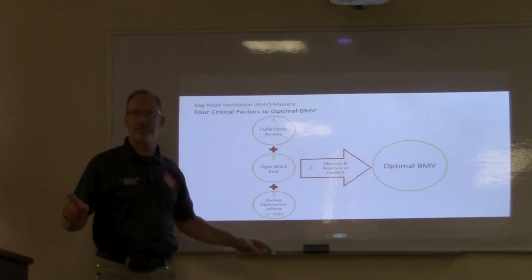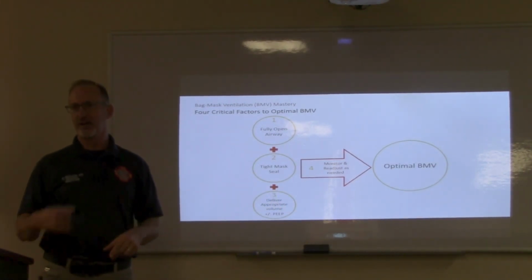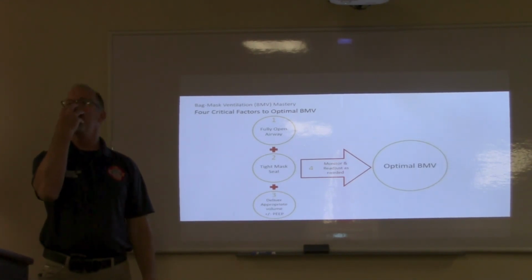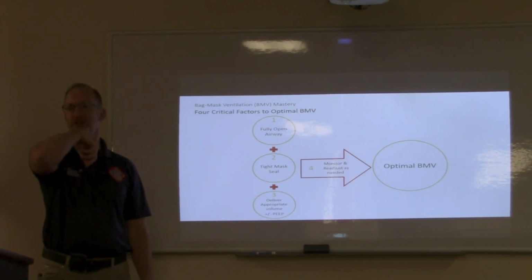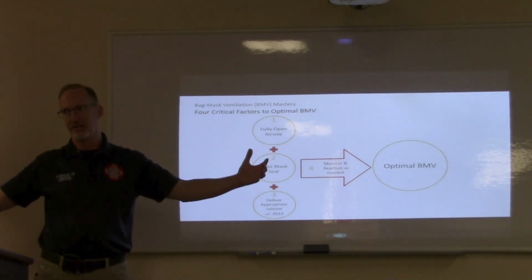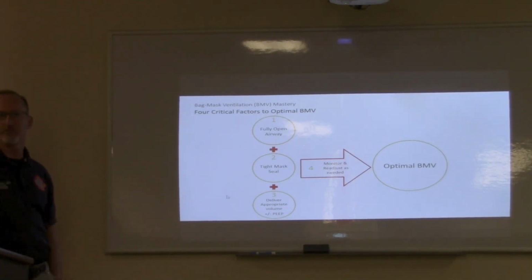Sometimes the issue of better bagging is to put in an LMA. Sometimes I count that as part of bagging, because if the problem is you couldn't get a seal, well, just move the mask from out here to in there. That's all extraglottic is. You're just doing better bagging. You're just creating a seal that's inside that you don't have to constantly maintain. So I kind of put that in the category of bagging or mask ventilation. It's just the mask in a different place.